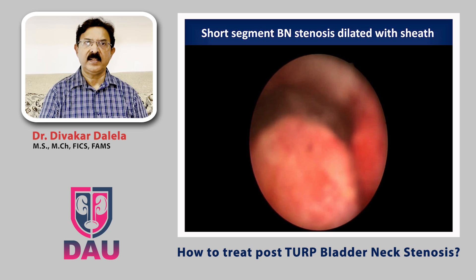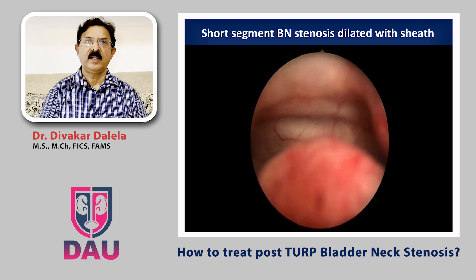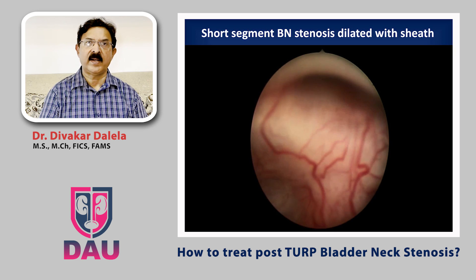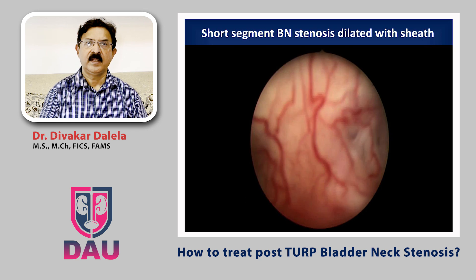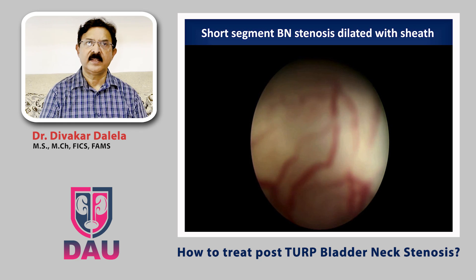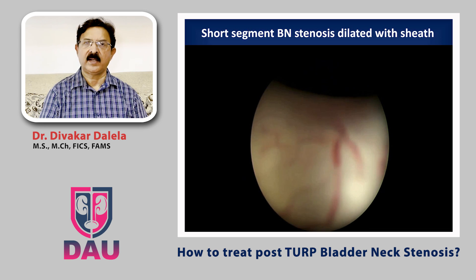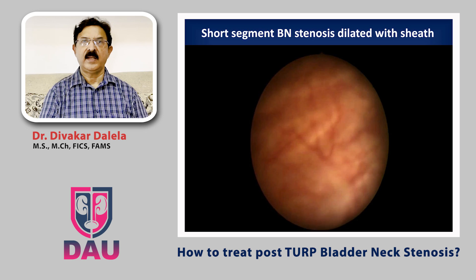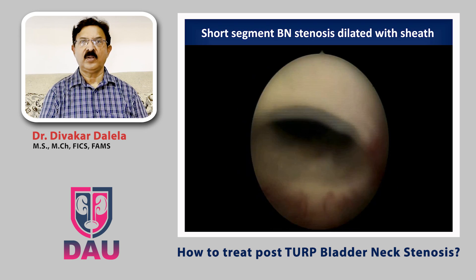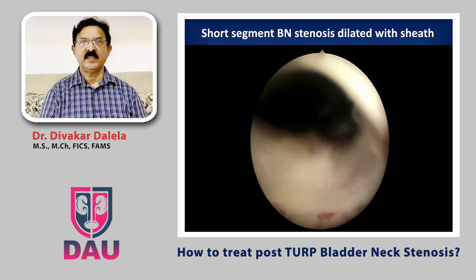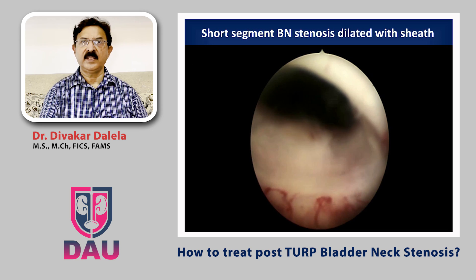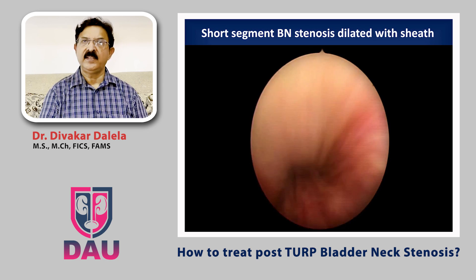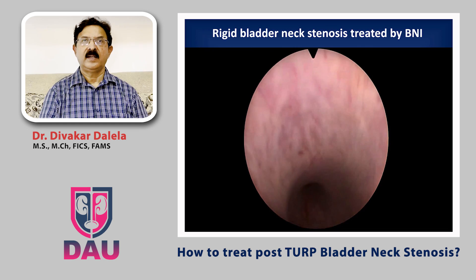Here is another case of bladder neck stenosis. This is the verumontanum and as you go close to the bladder neck you notice a narrowing. Look at the location of the narrow bladder neck — it is towards the 12 o'clock of endoscopic vision. You apply pressure with the sheath to enter the bladder, and gradually you go inside. The bladder shows some trabeculations which will happen in these patients. As you come out you will see the effect of dilatation on the bladder neck — you will notice some whitish scar. This patient will recur with bladder neck stenosis; the cystoscopic dilatation will not be enough. You can buy time with it but subsequently he will require a formal bladder neck incision.